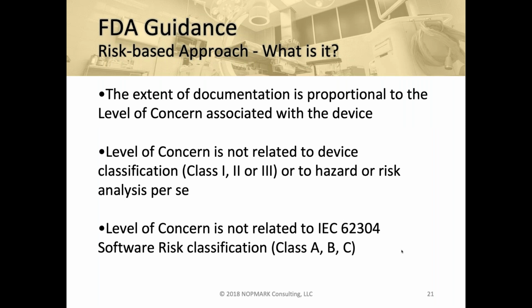And this does get into software testing directly, because part of that extent of documentation is how much unit testing, how much non-functional testing, maybe how much reliability testing, how much system testing coverage around different features, how much testing you have around things you identified as relating to risk. So a lot of this documentation does end up being test documentation.